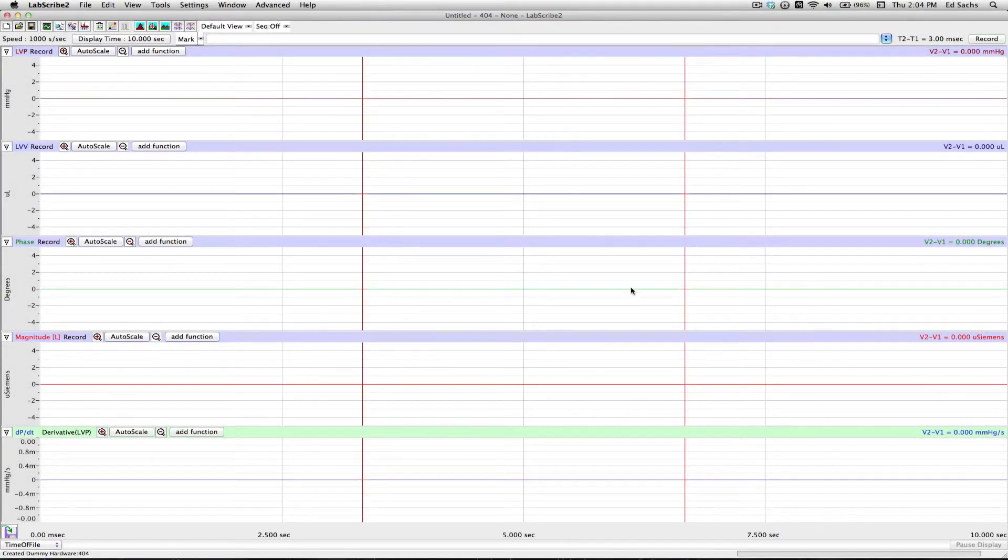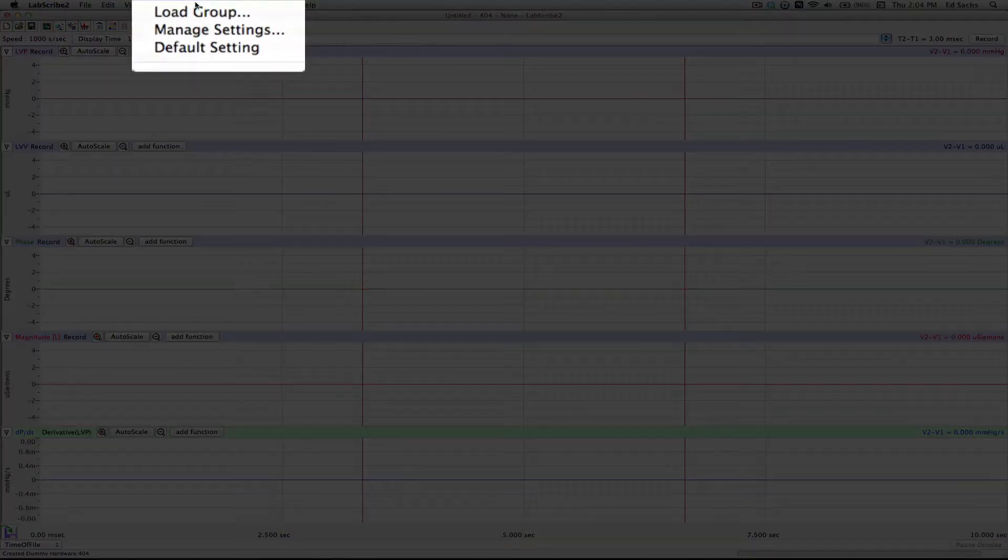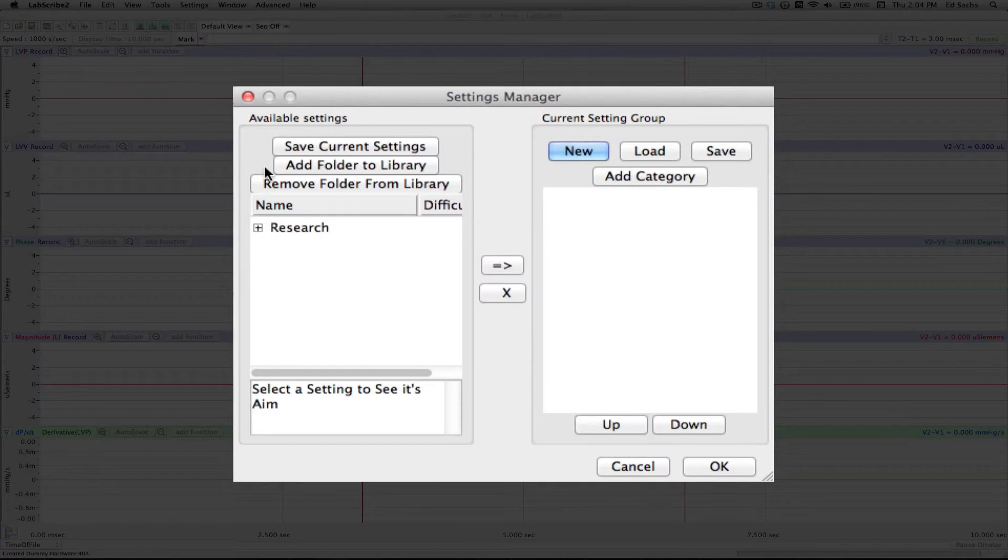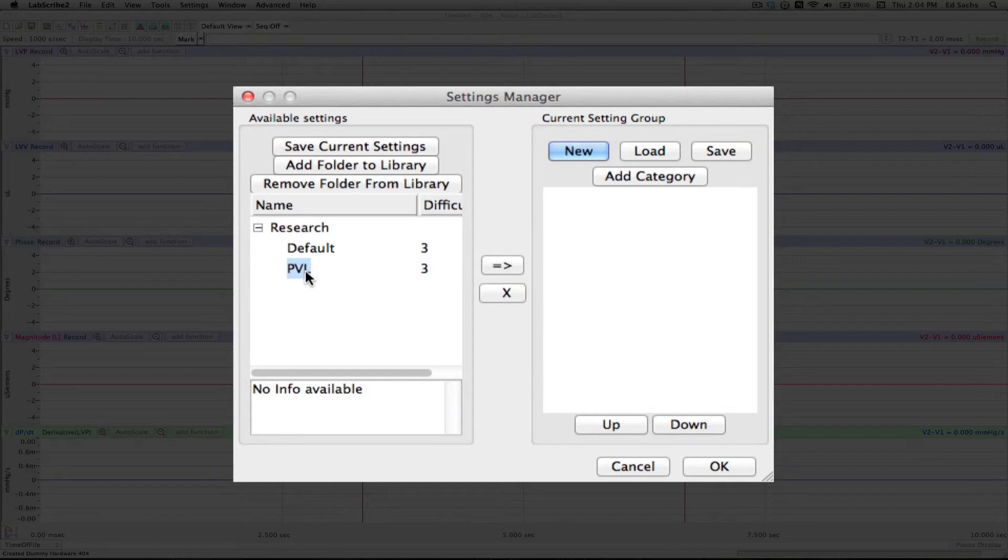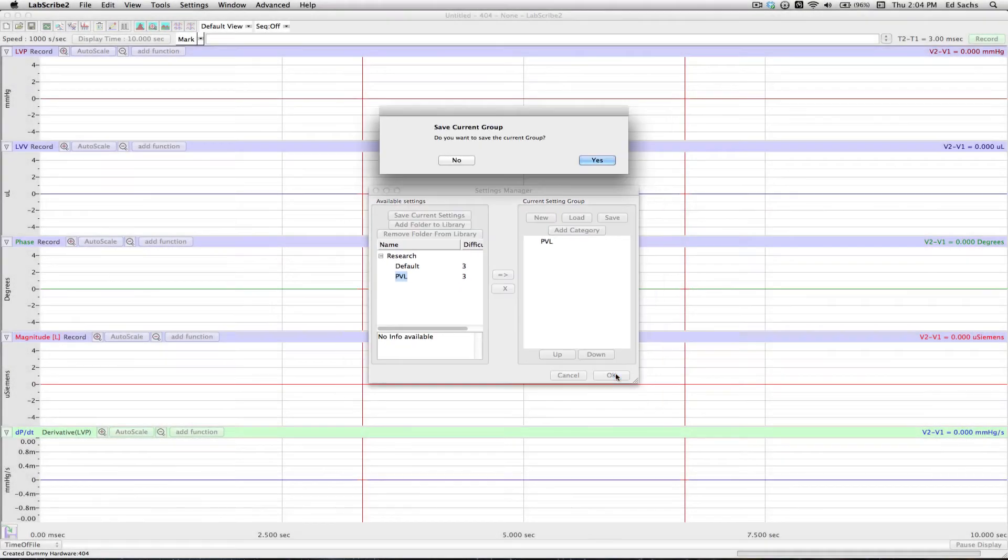And now let's add it to our menu so we can use it over and over. We go up to Settings, Manage Settings. There's our Research folder. I open it up, there's our PVL. I select it, move it over to the right, and hit OK. Now I just save everything.